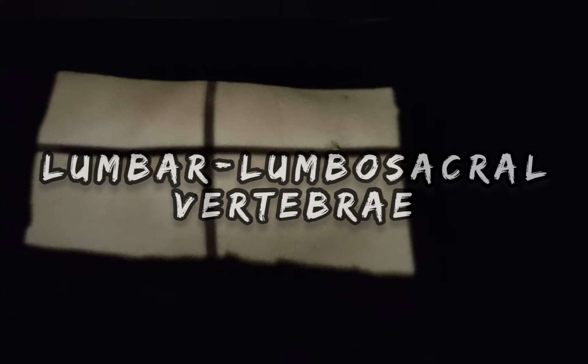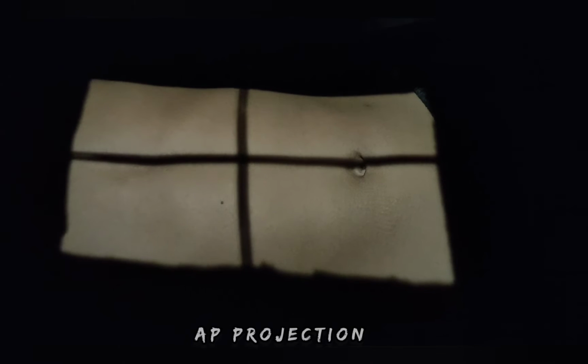In lumbar spine, I'm going to do the AP or PA projection and the lateral projection. So this one is the AP projection lumbar. Patient position is supine. Part position, align mid-sagittal plane to CR and midline of the table. Flex knees and hips to reduce lordotic curvature. Ensure no rotation of thorax or pelvis. Then CR perpendicular to IR. For larger IR, direct CR to level of iliac crest, L4 to L5. For smaller IR, direct CR to level of L3.